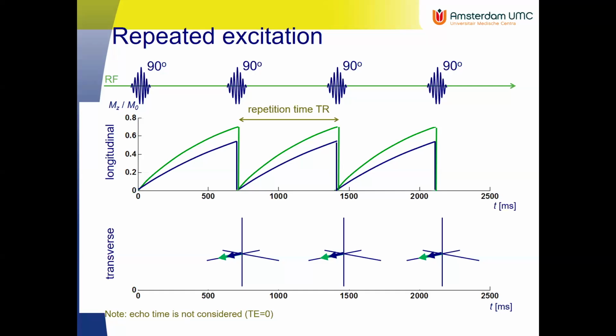And the net vector, the real magnetization vector, would be the vector add up of both longitudinal and transverse plane vectors. But to understand it and to think about it, it's really useful to split them up, because the net vector doesn't have a meaning.